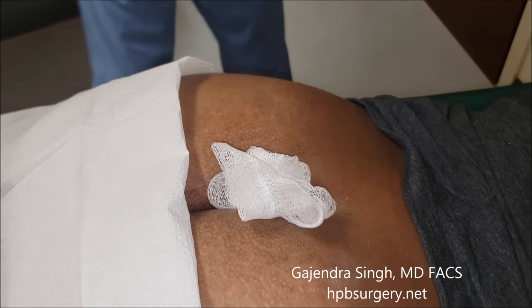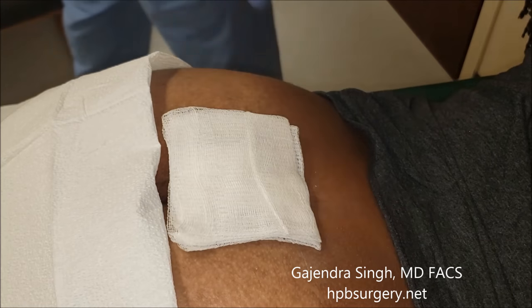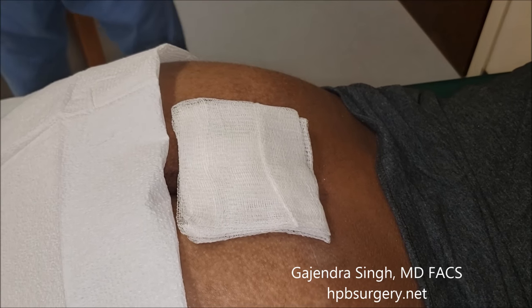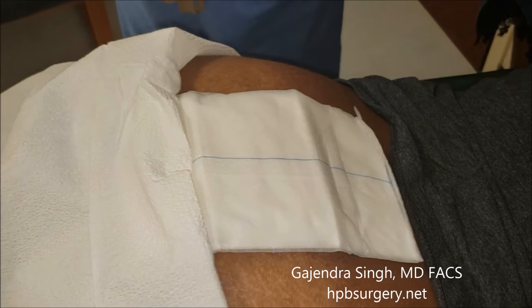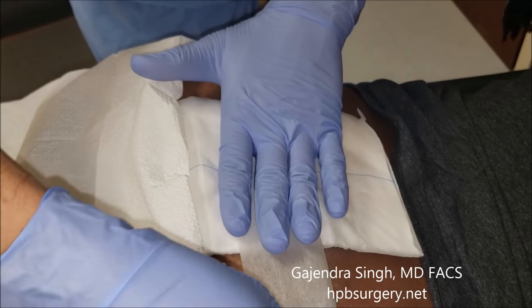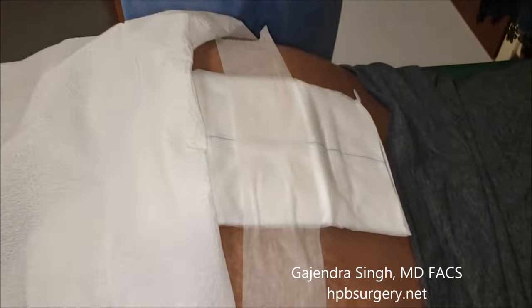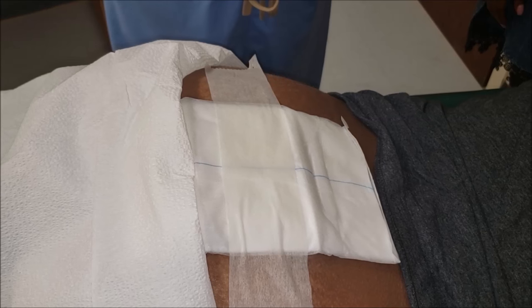We're going to put another gauze pad on it and that's it. Cover it up with the pad, put a little piece of tape over it, put the underwear back on and you're done. Don't use too much tape — just a little bit on the pad and some on the skin to hold it. The dressing change is done. For this large pilonidal abscess we'll continue to recommend changing the dressing twice a day, continue the antibiotics, and you'll get better. If you have any questions, give me a call.